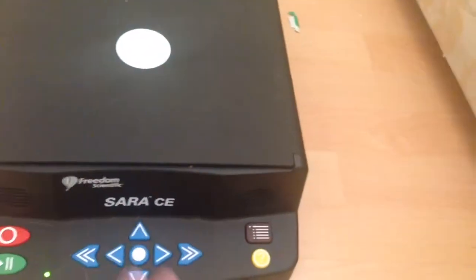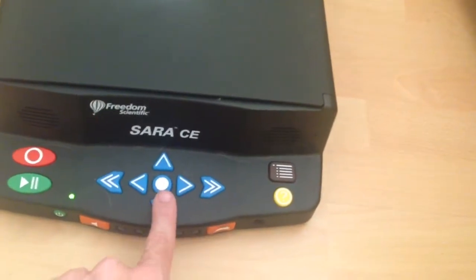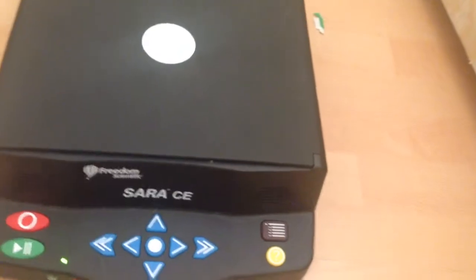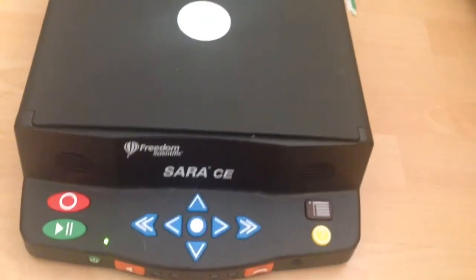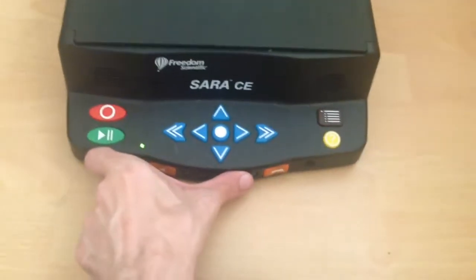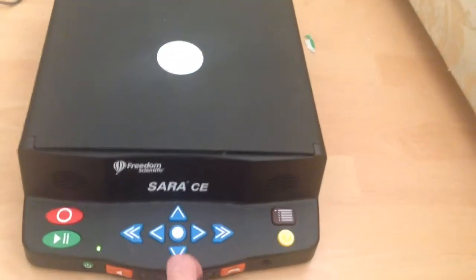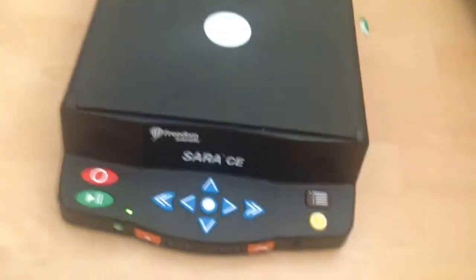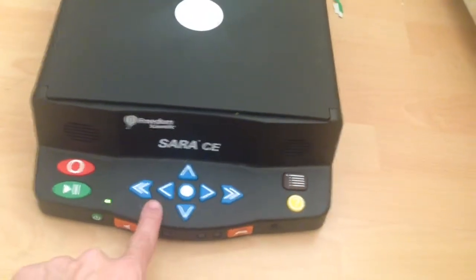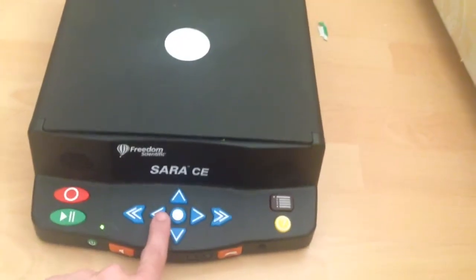This machine offers various functions via the menus, accessed by the menu button. There's a File submenu — you navigate with the up/down arrows. You can go to Voice Settings and change the voice or even the language; it has around 18 different languages. Freedom Scientific's documentation states the SARA has a 160 GB hard disk — it actually does not. This version has 32 GB of flash memory, so take that claim with a pinch of salt.